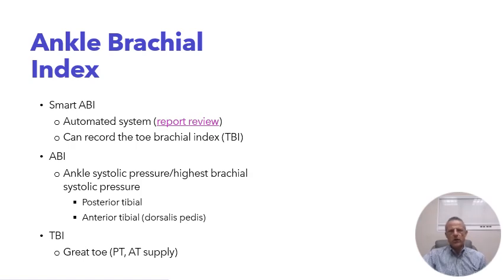Typically, we will look at blood pressures obtained at the brachial as well as the posterior tibial and the anterior tibial, or dorsalis pedis.